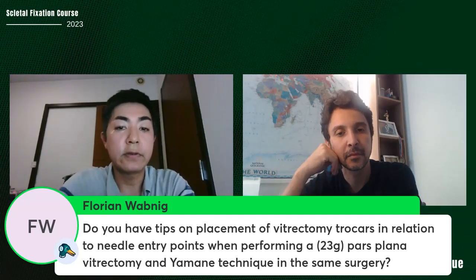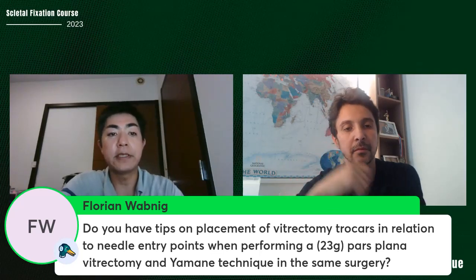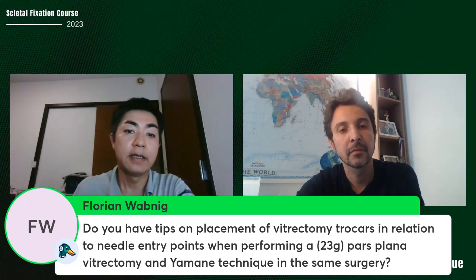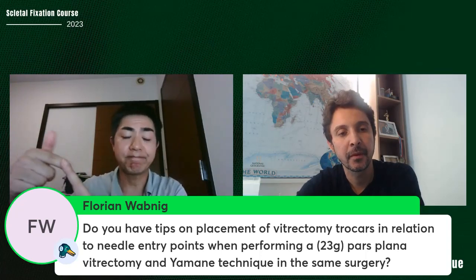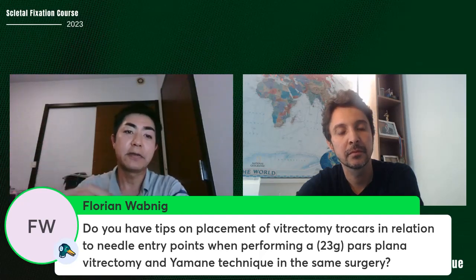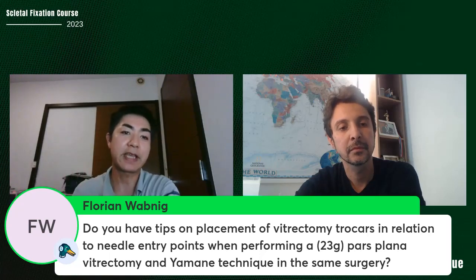I usually use 27 gauge vitrectomy, but that's the same as 23. As I showed you in the video, I always set the trocars and needle at the same position in the right and left eye. If you change it, there is a risk of interrupting the trocars. Trocars sometimes interrupt the insertion of the needles. So you must do just like me, or you should simulate before your case.